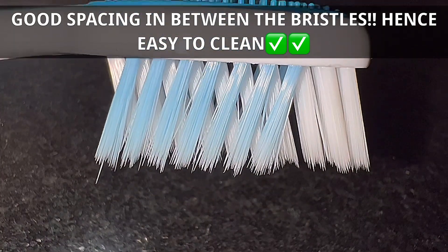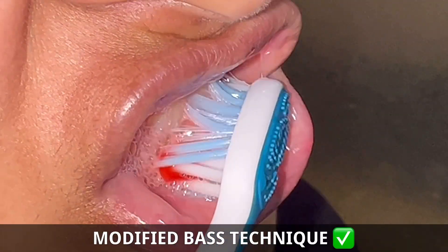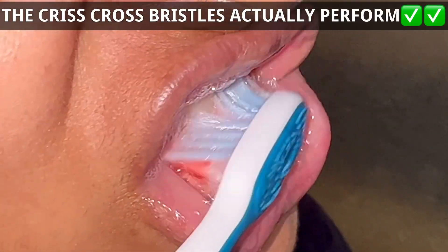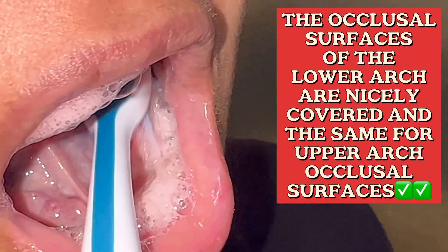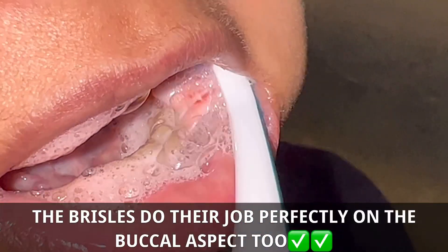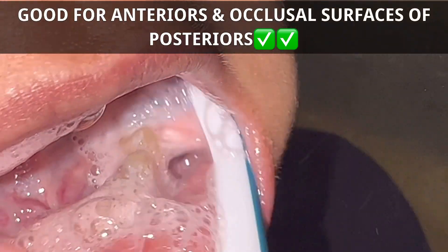Disinfection, cleaning, and maintaining the shelf life of the toothbrush is going to be very easy. Coming to the brushing aspect, you can see the anteriors being scrubbed upon and there is no discomfort of any kind. Even the occlusal surface of the lower arch is being scrubbed and a good amount of foaming is being produced by the toothpaste. In all, it is good for the anteriors.